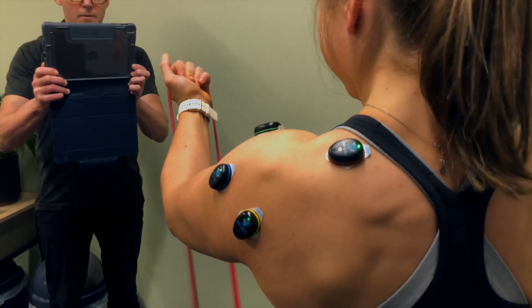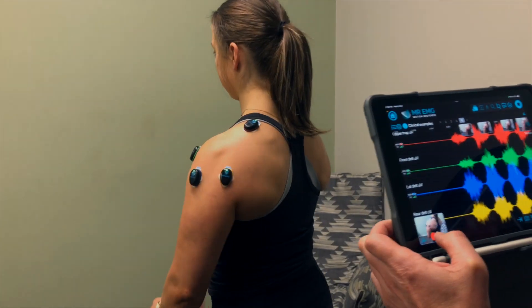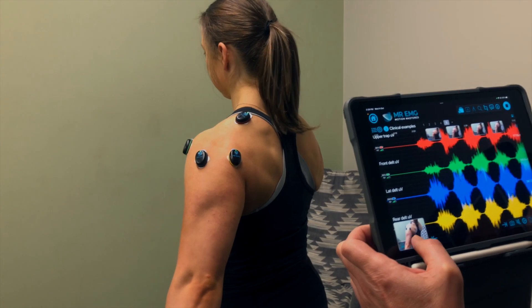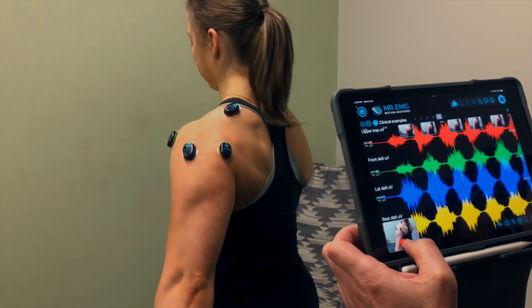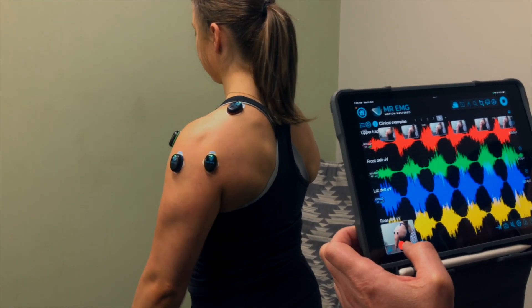To test the posterior muscle functioning, have your patient perform 8 repetitions of resisted shoulder extension. Observe the muscle amplitudes during the recording.